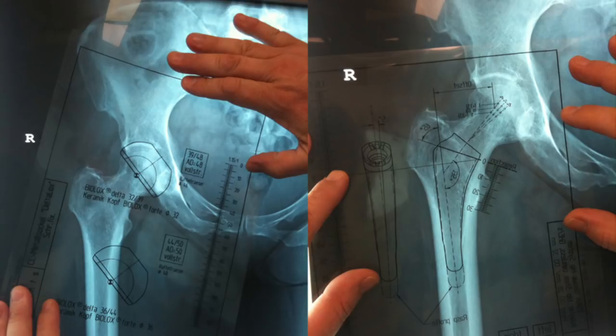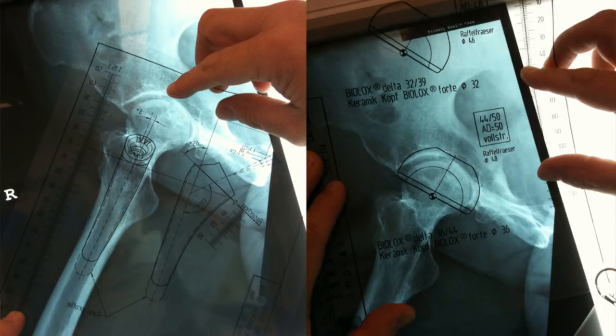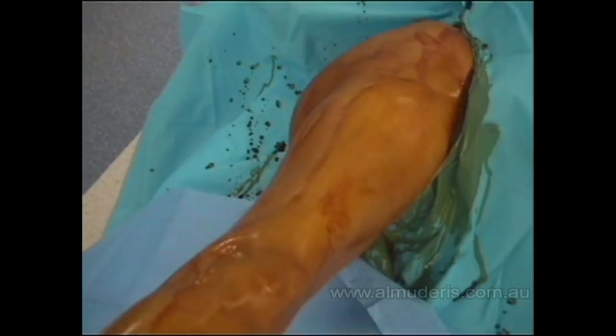The templating is done on the AP films of the acetabulum and the femur, and on the laterals as well, and that will give us an indication of the size of the implant needed to be used.